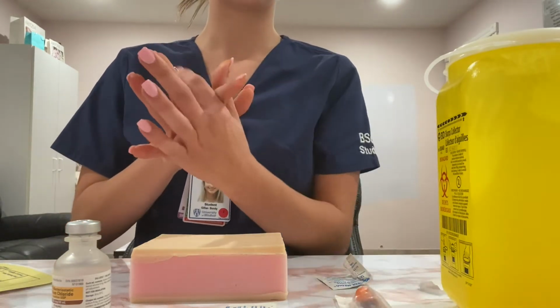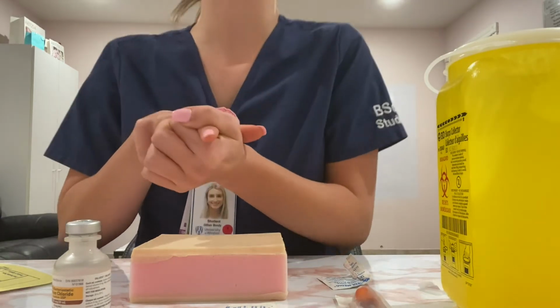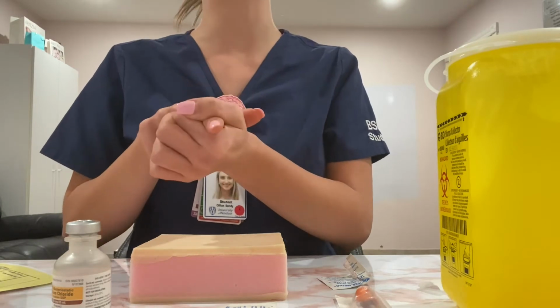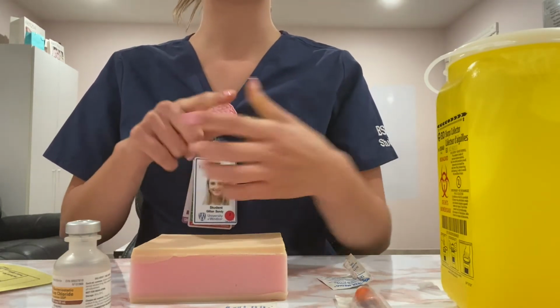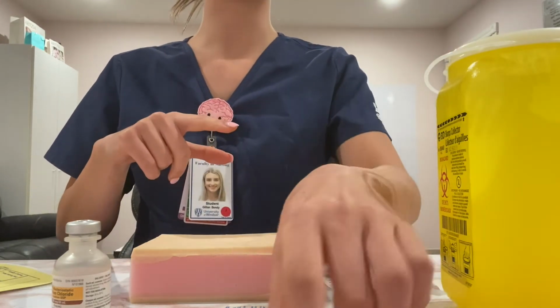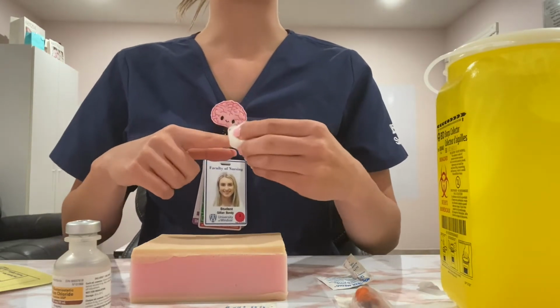And then I would milk the finger and hold so that all the blood goes to the end of the finger. And then the first drop of blood I would wipe away since it's mixed with the alcohol swab. And then I would use the second drop of blood to place it at the end of the machine. And once that's complete, I would place a cotton swab on the end of the patient's finger.